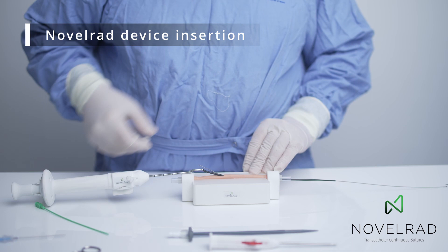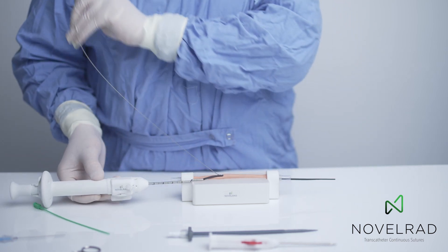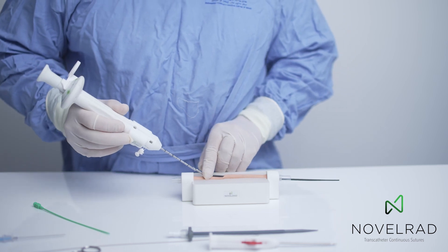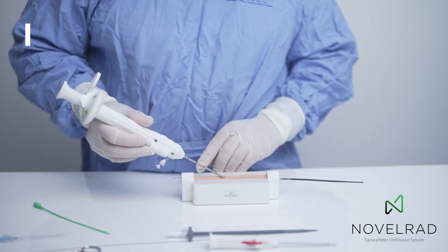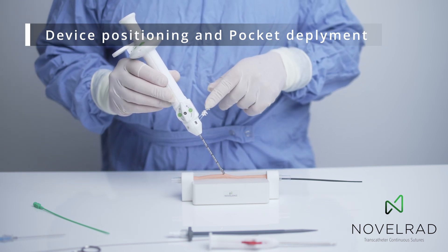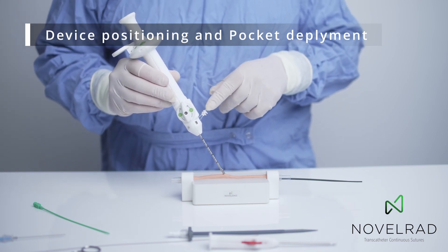Until we reach the area of the micro sewing machine, the catheter device is advanced into the vessel lumen. And if this vessel had blood, then the blood would be coming out through the bleeder to demonstrate exact positioning.